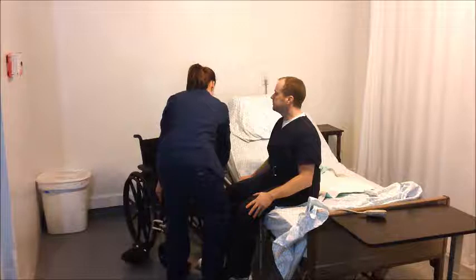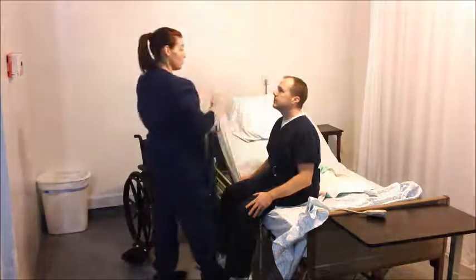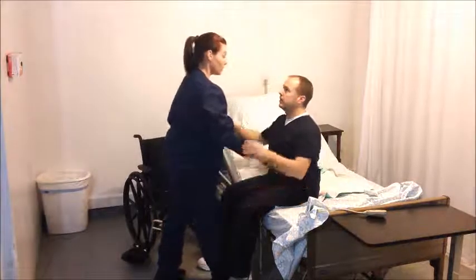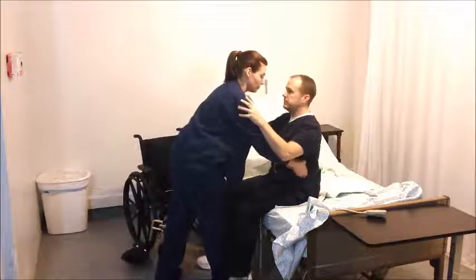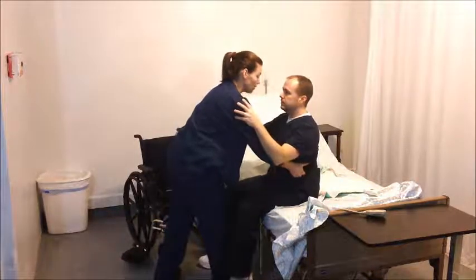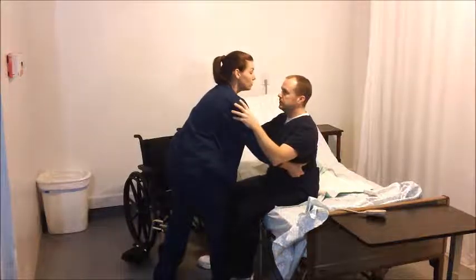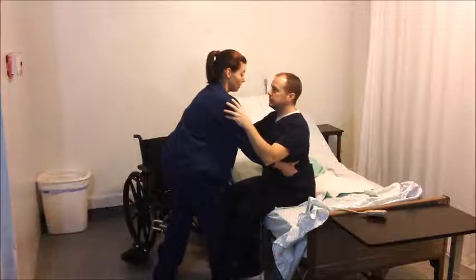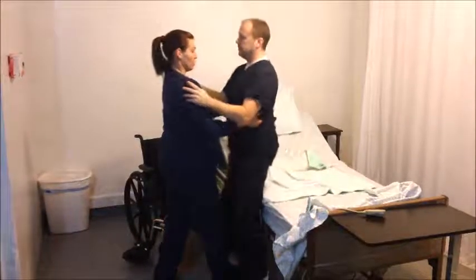Stand facing the client, reaching under the client's arms to hold the transfer gait belt at the sides or around the back throughout the transfer. Brace one or both of the client's legs and count to 3 or say another prearranged signal to alert the client to begin standing. On signal, gradually assist the client to stand by grasping the transfer belt on both sides and transfer the client as a pivot, completed without having the client take steps to reach the wheelchair.